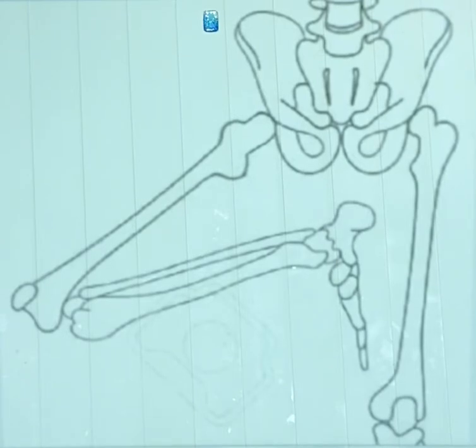For the centering, it's going to be perpendicular at the midsagittal plane, which is 1 inch superior to the pubic symphysis. So this is the pubic symphysis. 1 inch above would be around here. So the perpendicular centering is going to be right in this area.